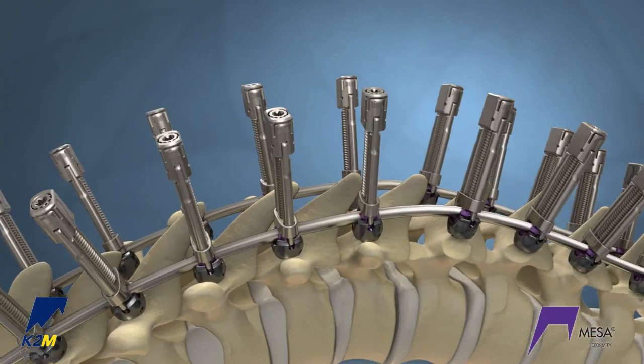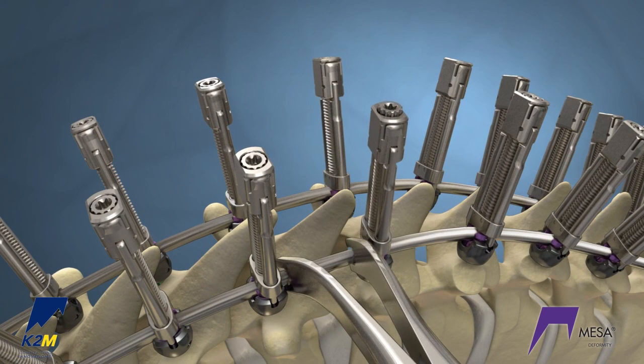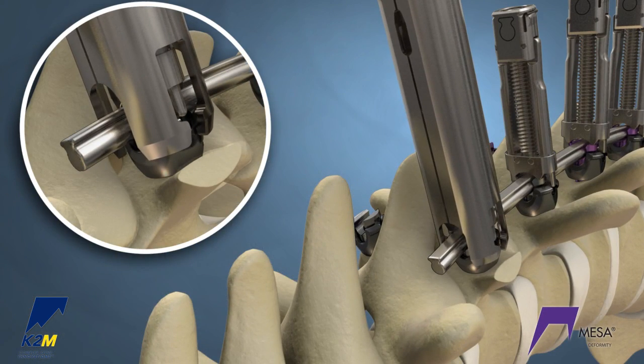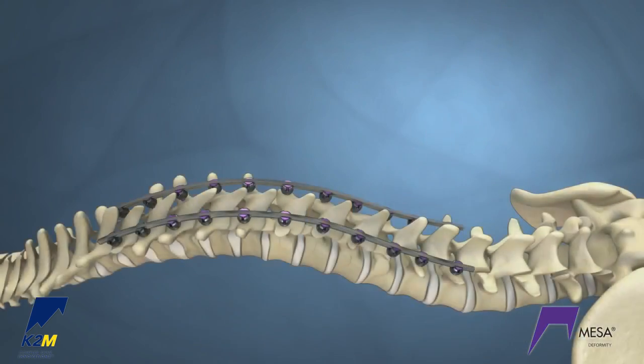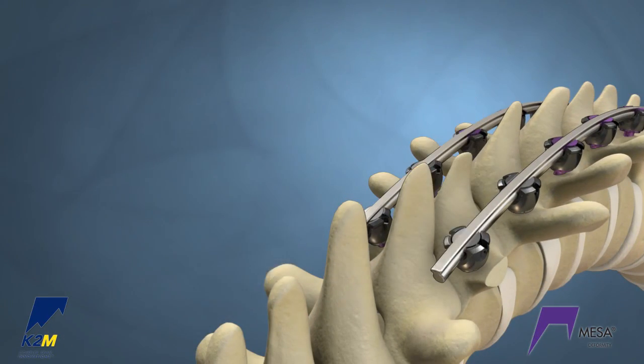If compression or distraction is desired, loosen the cricket, compress or distract, and retighten. Repeat the same sequence on as many levels as desired. Finally, use the superfly to partially lock each MESA screw. Remove the crickets and final lock the screws with a quick locker to complete the construct.